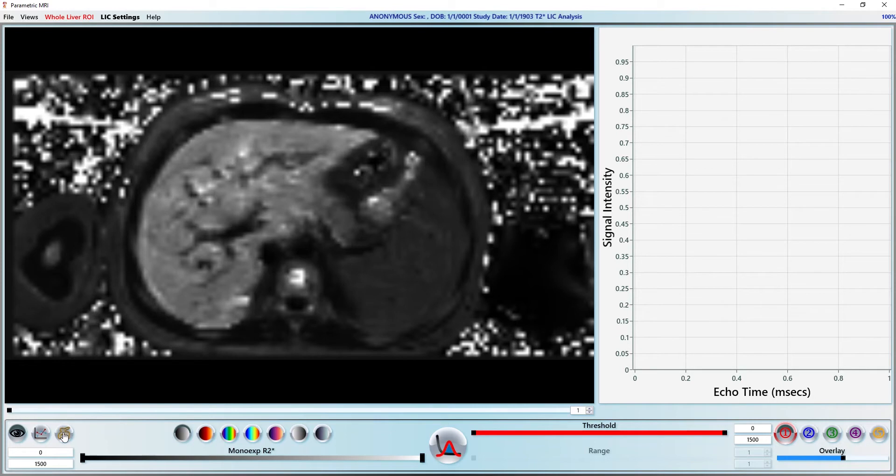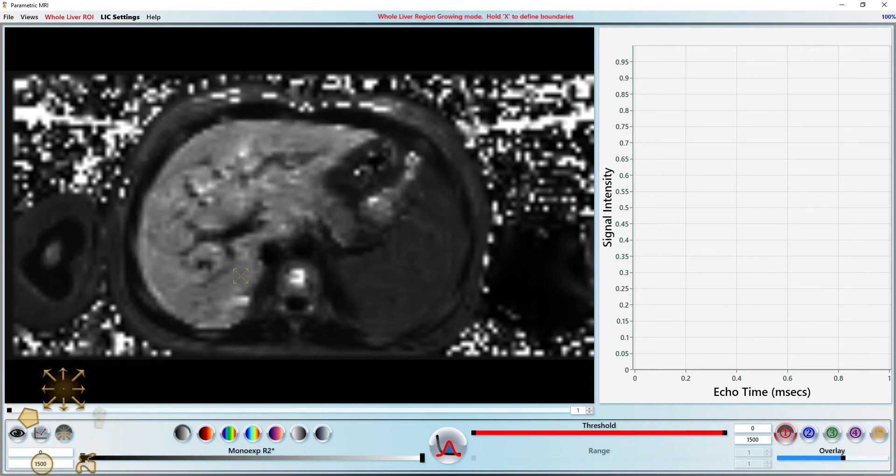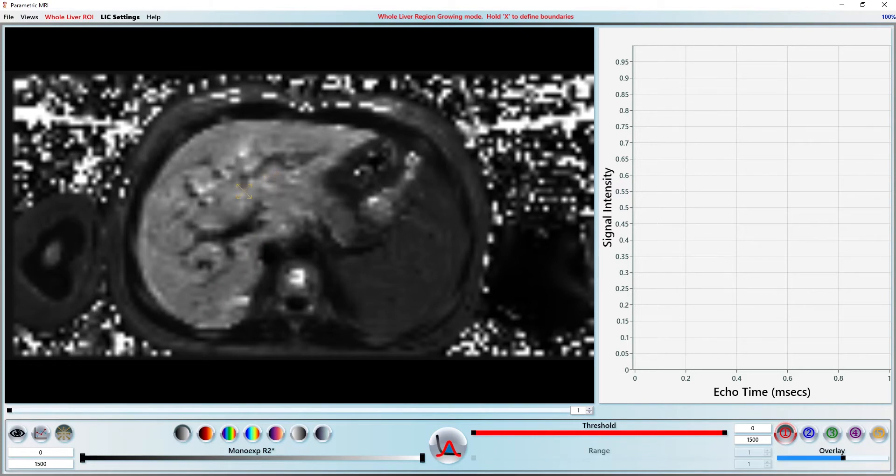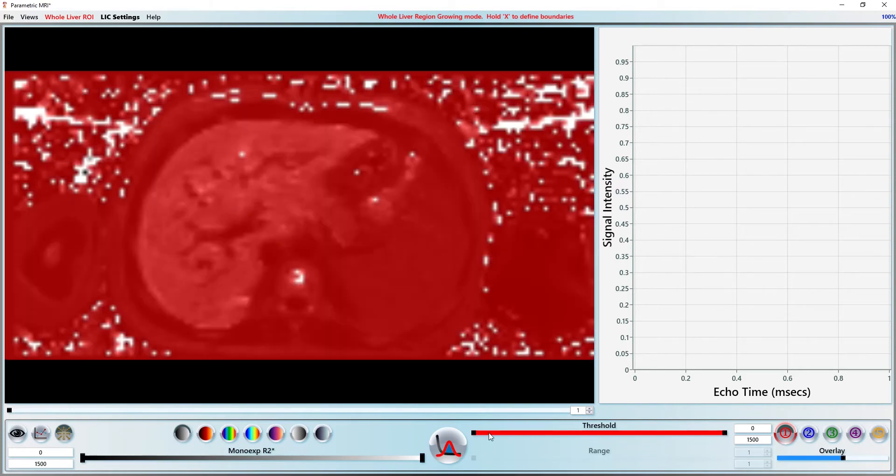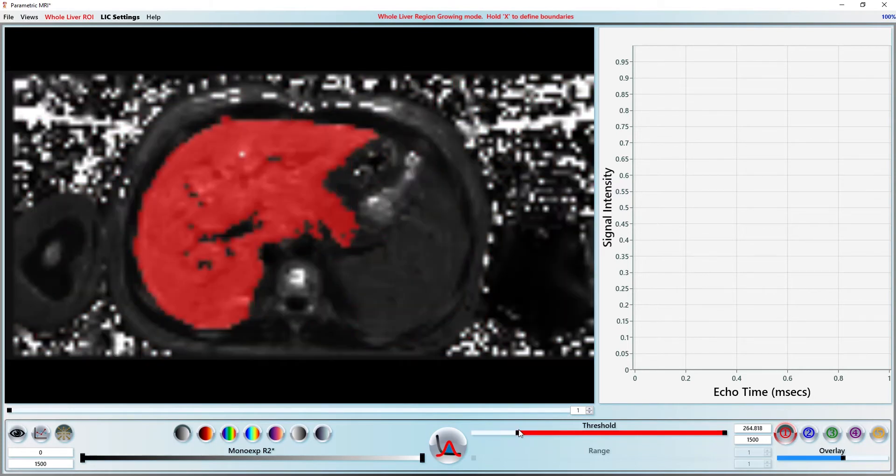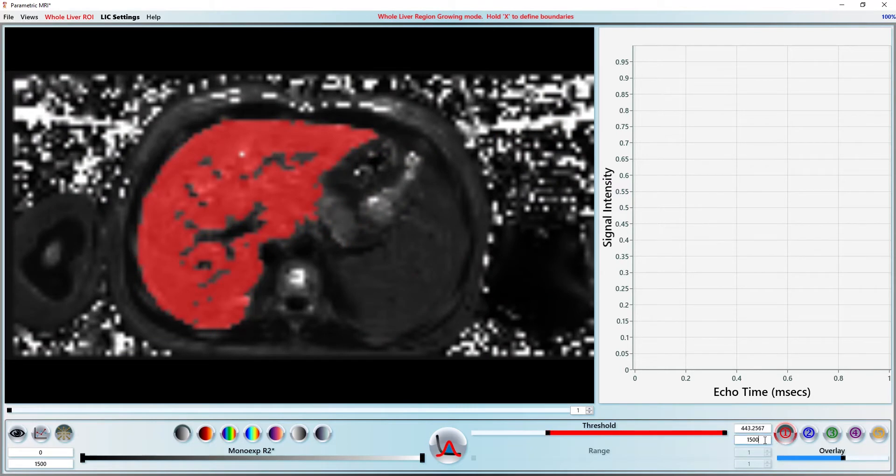Select the region growing tool by right clicking on the ROI drawing tool or pressing 3 repeatedly on the keyboard. Click on the liver to drop a seed and adjust the threshold as necessary. I prefer this method for liver segmentation because it allows me to easily define the liver boundary as well as exclude vessels only by adjusting the threshold.